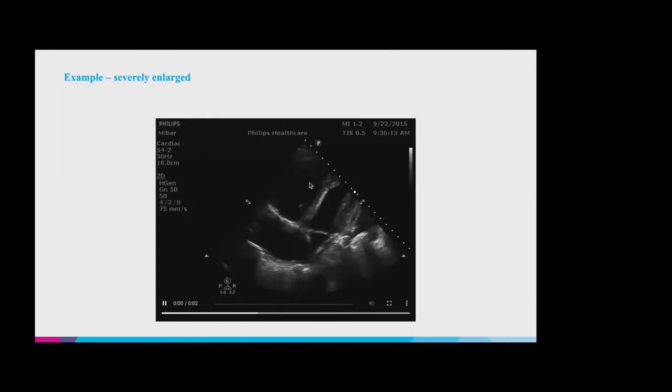The other thing I would point out as well is look at the septal wall. Anytime you see it bowing into the left ventricle abnormally, right? So the left ventricle normally should be dealing with much higher pressures. So the septum should be bulging out towards the right ventricle. So anytime it's bulging towards the left ventricle, that's definitely concerning for RV dysfunction. So this is someone that if there was a PE, we would definitely be activating PERT and considering advanced therapies like catheter-directed thrombolysis, surgical embolectomy, TPA, et cetera.